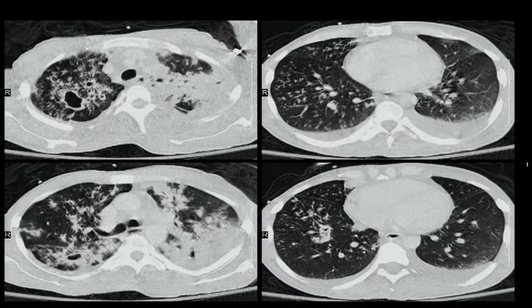This is pulmonary tuberculosis. Whenever you're practicing and you see a cavitary lesion, even if I didn't see pleural effusion, because in post-primary TB, usually you may or may not have pleural effusion. It is primary TB that presents with pleural effusion. Anyway, so this is TB. Very good. What other findings do you see in TB?